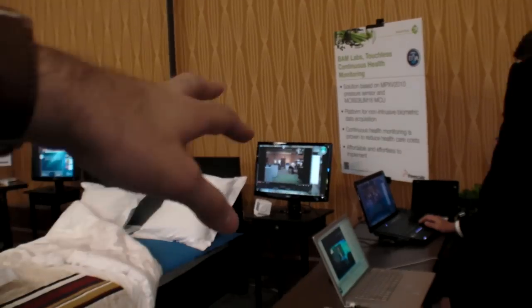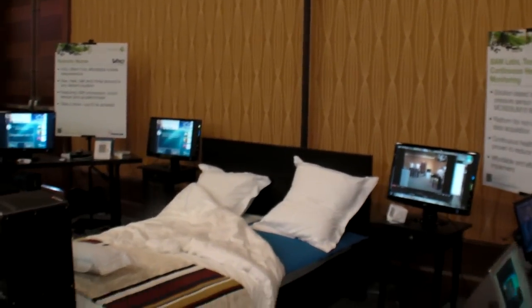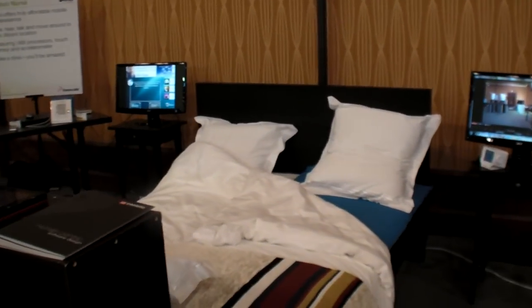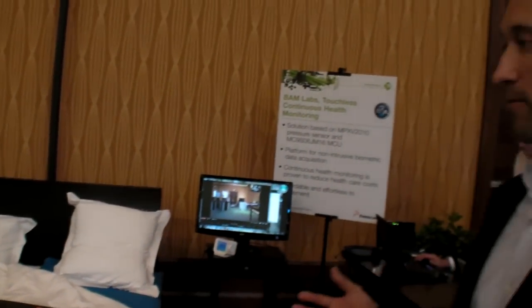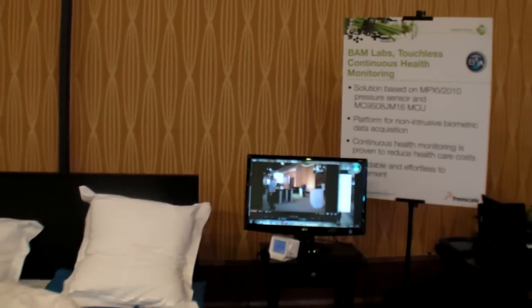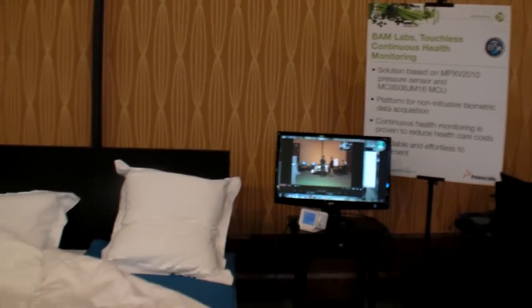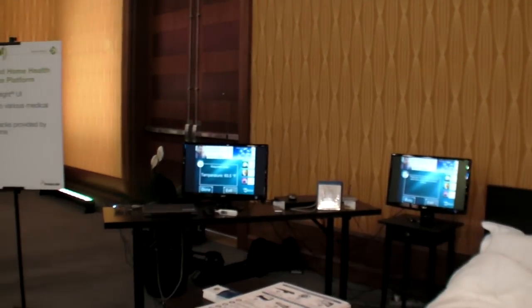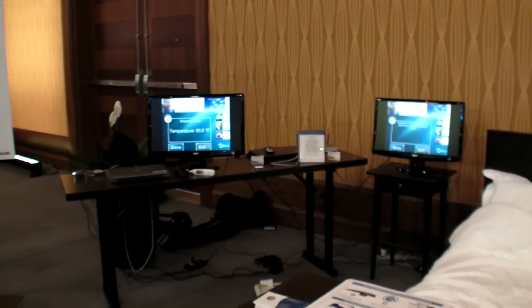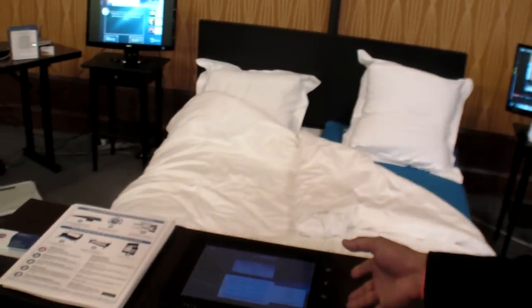So he's driving the Vigo robot over there. And what is the bed supposed to show? The bed is a typical bedroom for a potential elderly person, someone with a chronic condition. With that, we have the Chumby alarm clock, which is able to wirelessly take in data from both the biometric sensor, as well as things like a blood pressure monitor, a weight scale, a glucometer, or a thermometer. And all of that data can then be transmitted to a tablet that's also powered by an i.MX ARM solution.